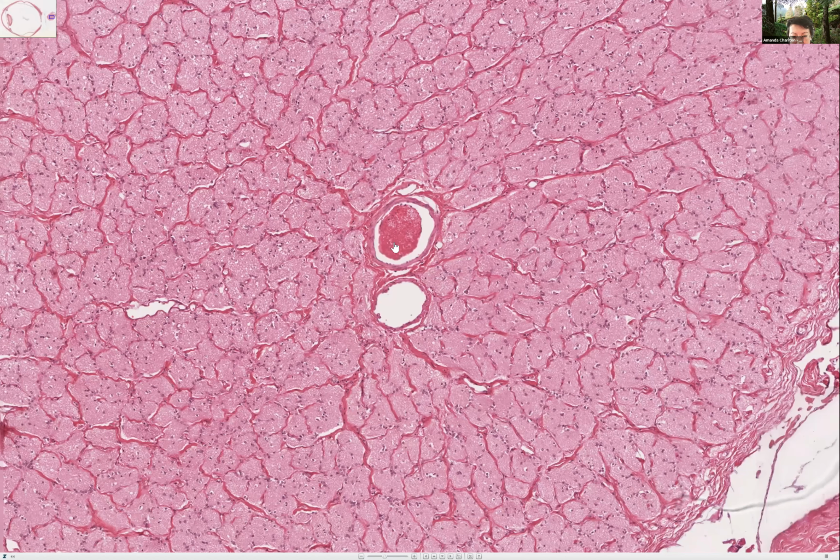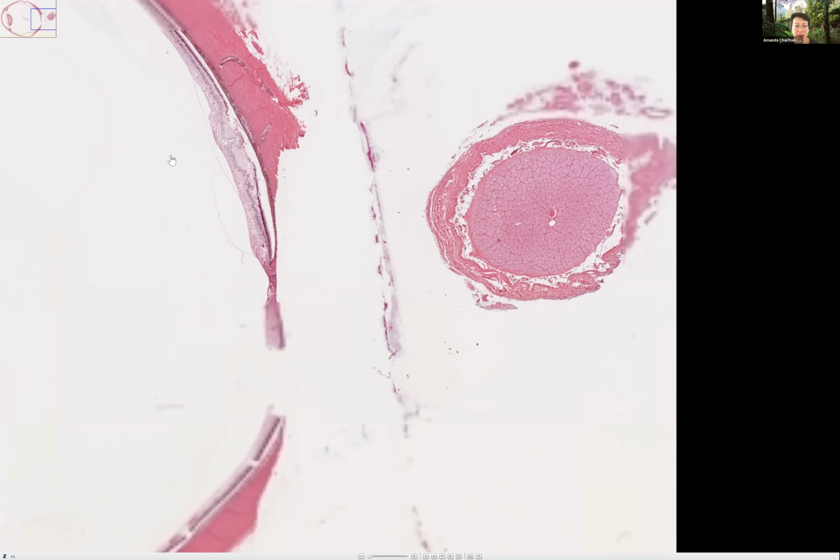Here we go, I won't go too close. So the light pink material probably would be fibrin. There's some nuclei in here, maybe of white cells, and there's a mat of red cells. So I wonder if that might be a thrombus, not entirely certain, but the consequences in the globe that I can see are ischemic inner retina around the macula, compatible with the central retinal artery occlusion.